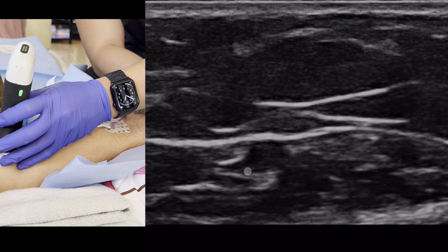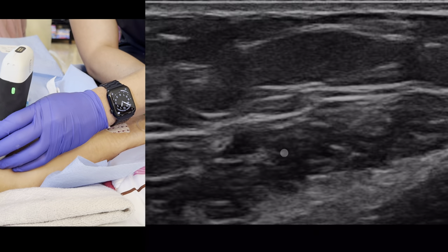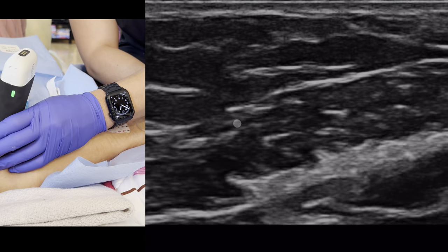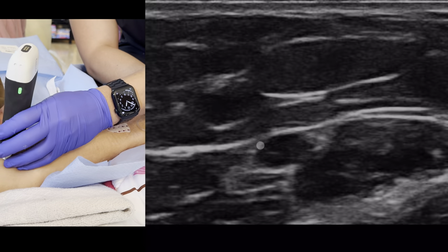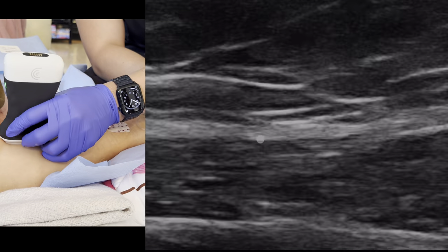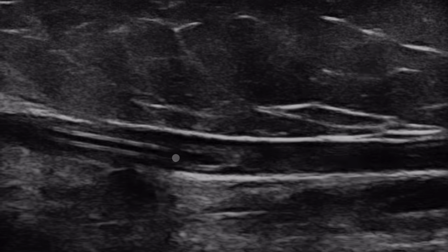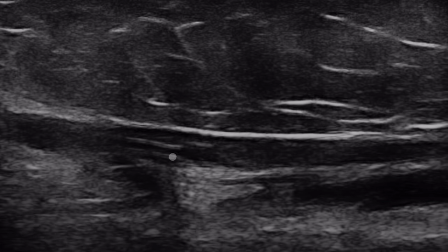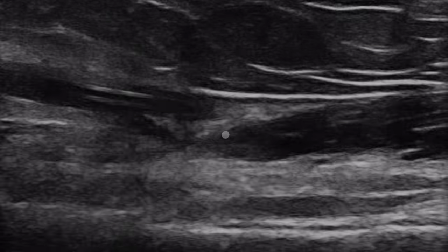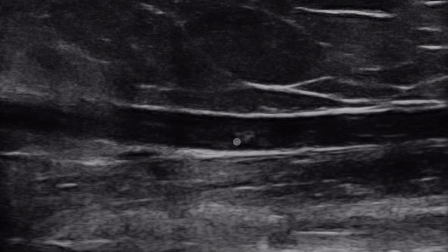Let's find the tip of the catheter — right about there. The vein right here is pretty compressible — probably has a decent flow rate. Look at that — complete compression, vein wall to vein wall. However, let's observe the catheter tip. Today I'm actually using the Clarius, which has a much cleaner image but has its own drawbacks we'll talk about later. This part is distinctly the catheter and it stops right about here. I'm not sure if it extends this way or if this is a clot. Luckily, this is not a life-threatening clot — it's just a nuisance of an extra-luminal thrombosis, probably even a fibrin tail.